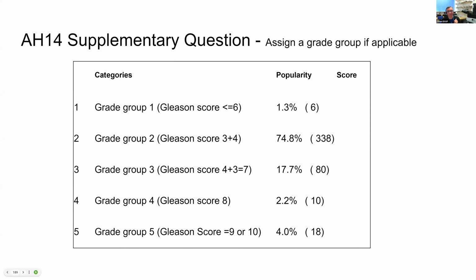Yeah. Great. So the Gleason grading, so the supplementary question when there's adenocarcinoma is the Gleason grade, to which we usually approach this as we have a preferred Gleason grade, which is normally the one that we have most consensus over, and that would appear to be 3+4 in this case, which is interesting, given 3+4, 4+3.